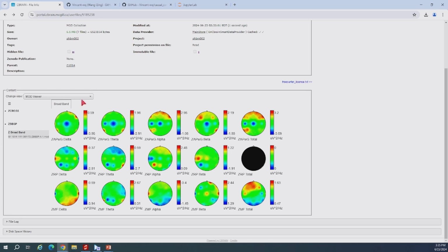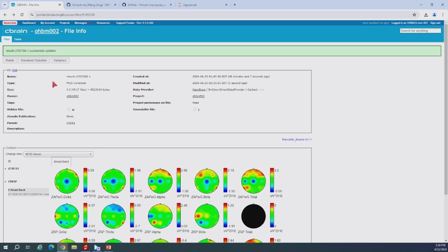This is the most well-known quantitative EEG analysis, because people used to summarize the results by frequency bands. People don't use to look at each frequency. They always like to summarize and see by frequency bands. So this is one thing that we can do.